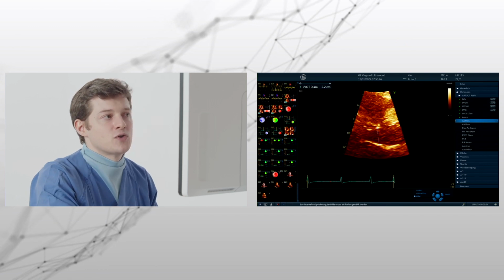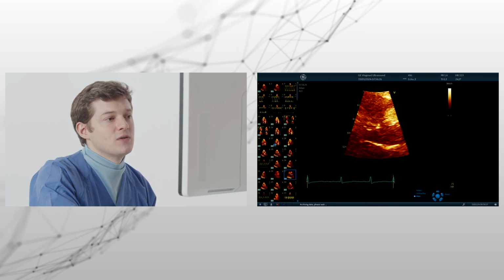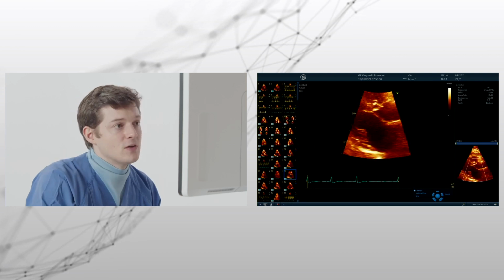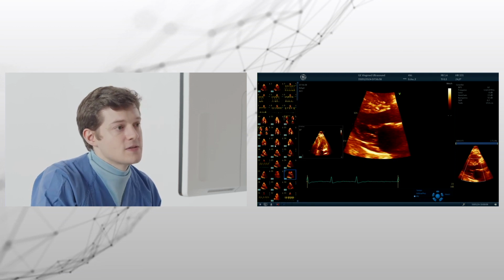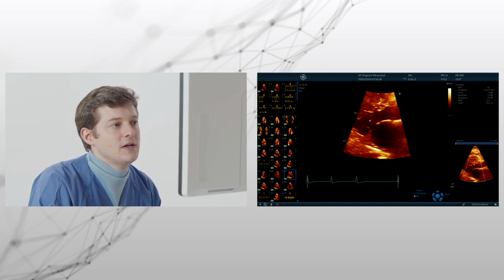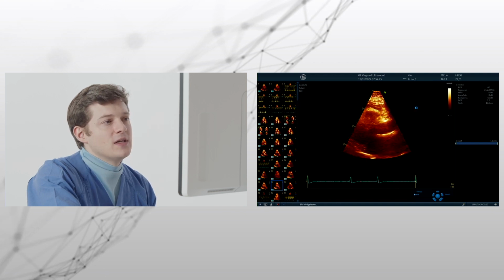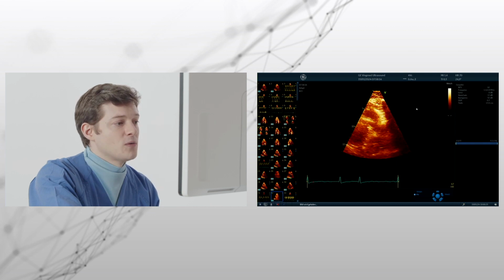And if you're not sure and you have an error in measurement, you go back and measure the LVOT again. Here you can also measure the LVOT, so we have two images, so it's rather okay. We do not see a relevant SAM. This is zoomed, so we do not see a relevant SAM, so really the chorda, the elongated chorda, move inwards the LVOT. Color Doppler again, but we continue with our TR measurements, which we simply cannot in this case, so we do not measure it.